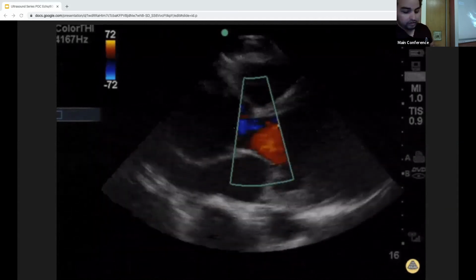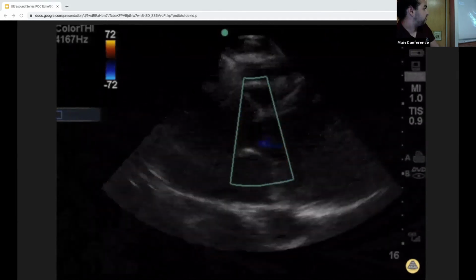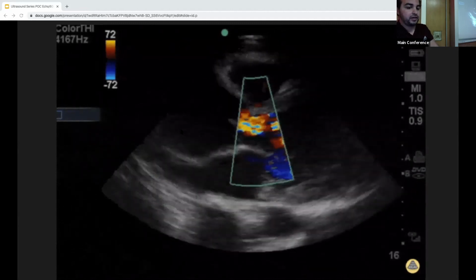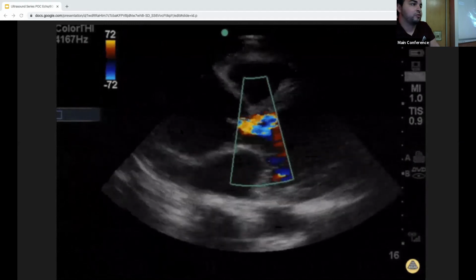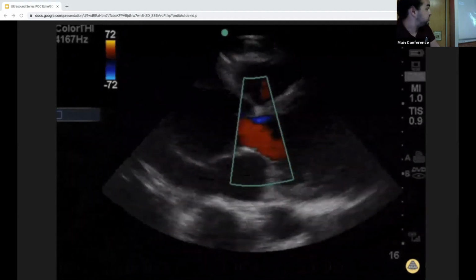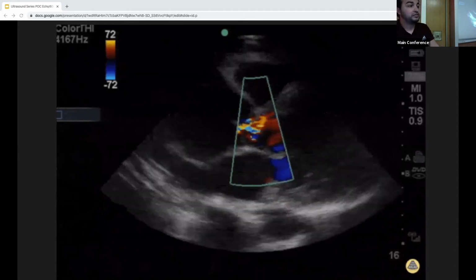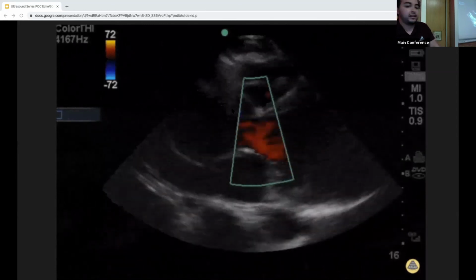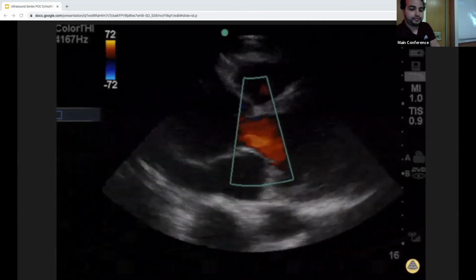You can see in the middle of the screen here, right where my mouth is, this huge aneurysm. This is the aortic outflow tract. It should not be this big. If you were to measure this, this is probably greater than 4.5 centimeters, which is considered to be abnormal. If you see a dilated outflow tract, that means the person is at risk for dissection. Just know that not all dissections are aneurysmal and not all aneurysms dissect. They're just at risk for it.